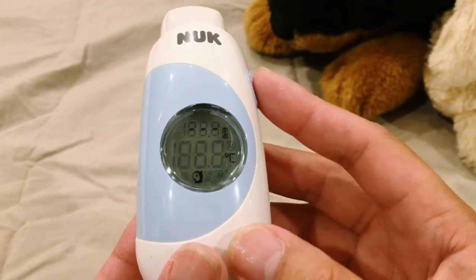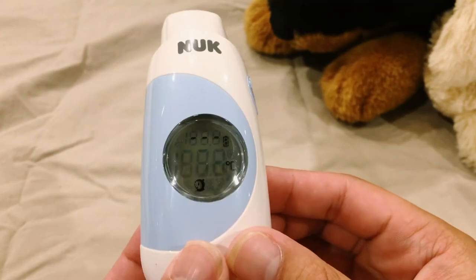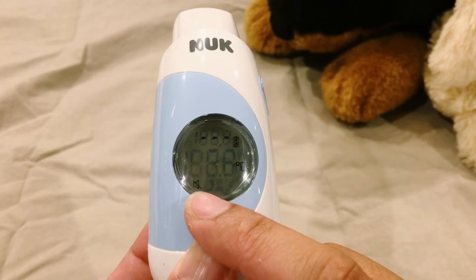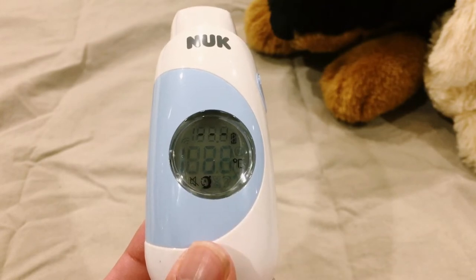The thermometer also has a silent mode. All you have to do is hold the on and off button until the silent mode symbol starts flashing in the display. You can do the same again to deactivate the silent mode.